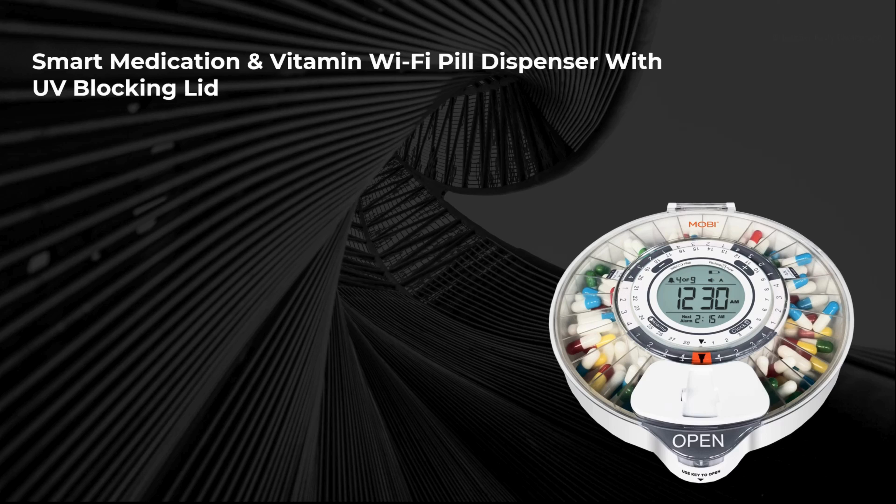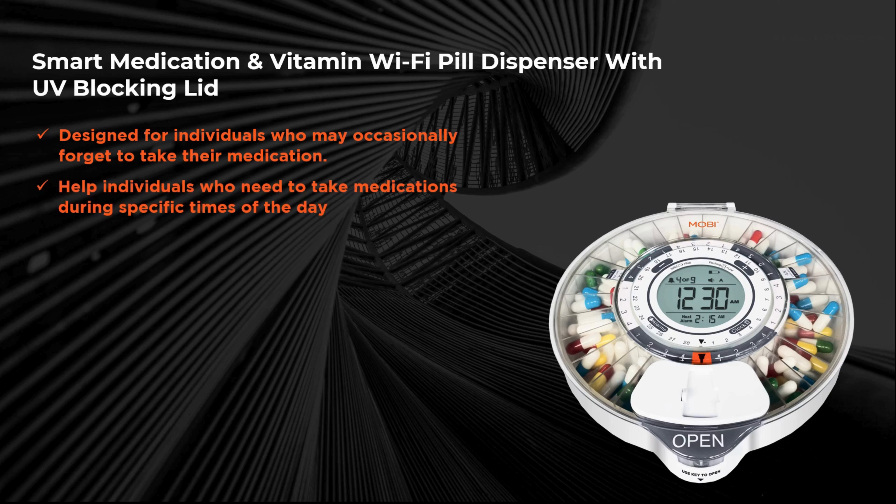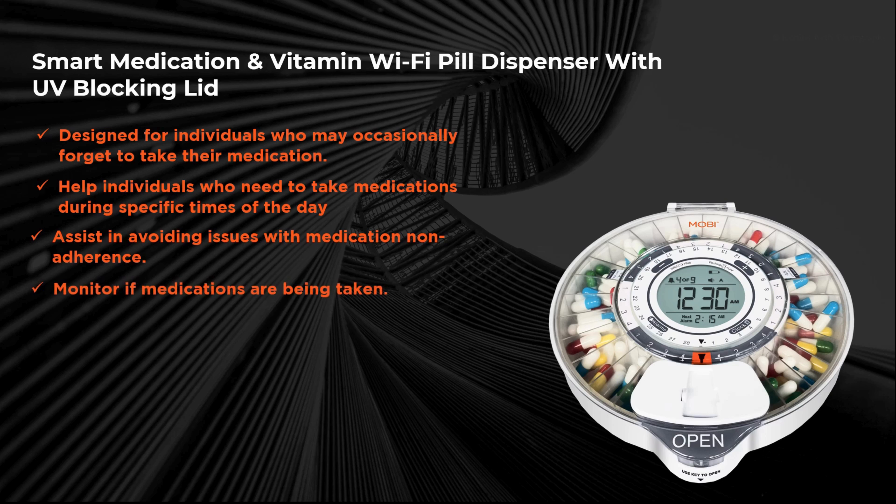The Mobi Pill Dispenser is designed for individuals who may occasionally forget to take their medication, helps individuals who need to take medications during specific times of the day, assists in avoiding issues with medication non-adherence, and gives caretakers the ability to monitor if medications are being consumed.